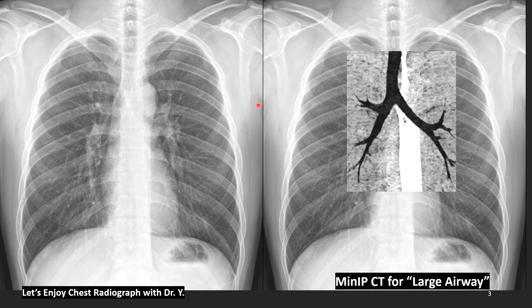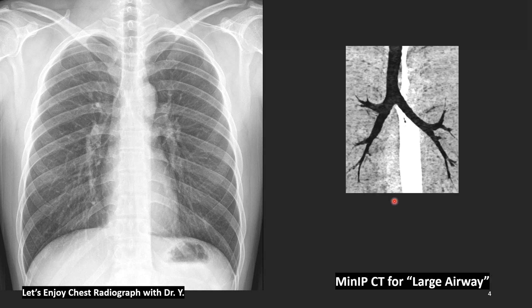We need imagination and knowledge of these large airway structures to identify the large airways in the chest radiograph. Here is the trachea, right main bronchus, right upper and lower bronchus, bronchus intermedius, middle lobe bronchus, lower bronchus, left main bronchus, upper and lower bronchus, lingular segments, and lower bronchus. Now you can see the large airways. I will now remove the background chest radiograph.